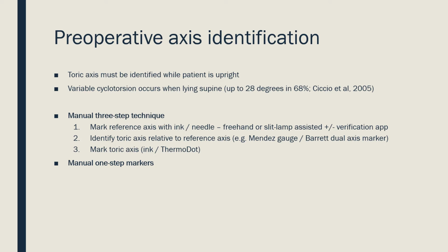There are some devices that can achieve all of this in one step, and we'll see an example of that shortly.